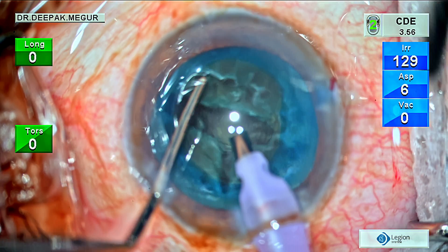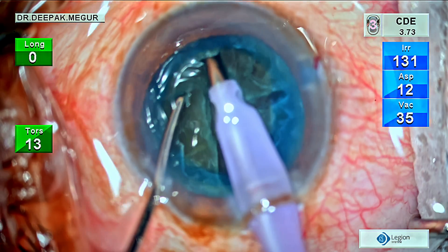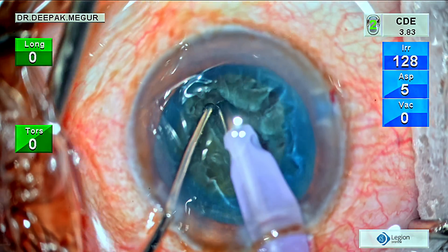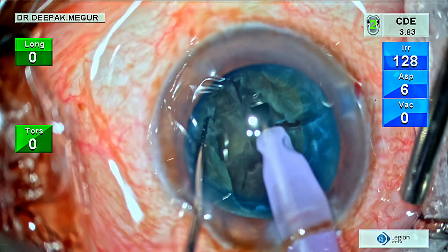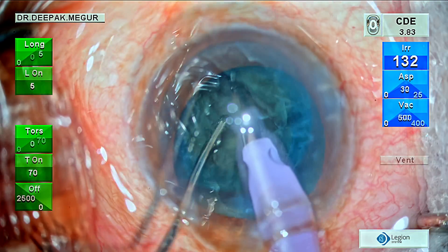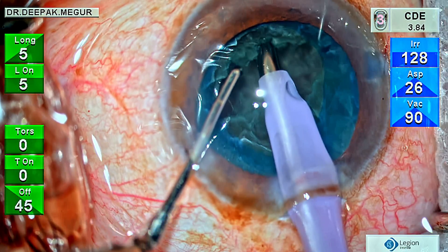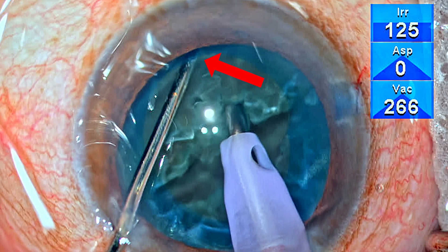I'm stroking the nucleus to get a decent enough depth. Once I feel the depth is good enough, I'm going to try lateral separation. As expected, the two heminuclei can be separated at the peripheral part, but the central part is too gummy and refusing to split at the center. Nevertheless, we have two smaller fragments. In the other heminucleus, I place the chopper lightly towards the periphery near the equator — something like a modified horizontal chop.